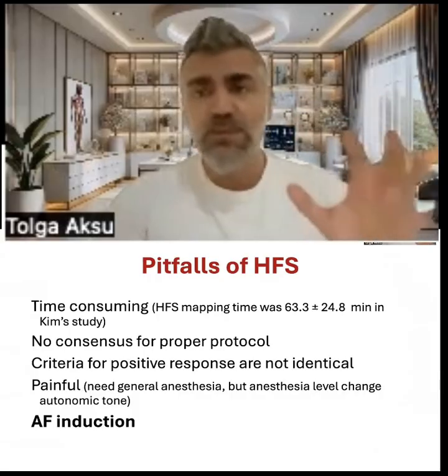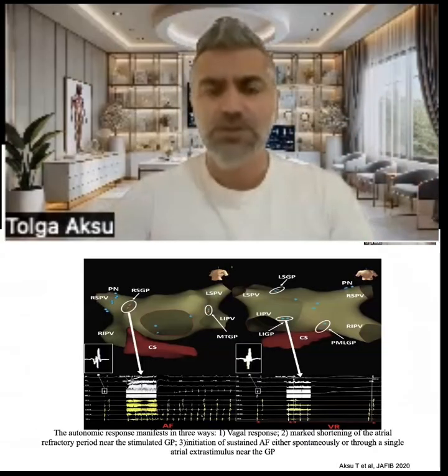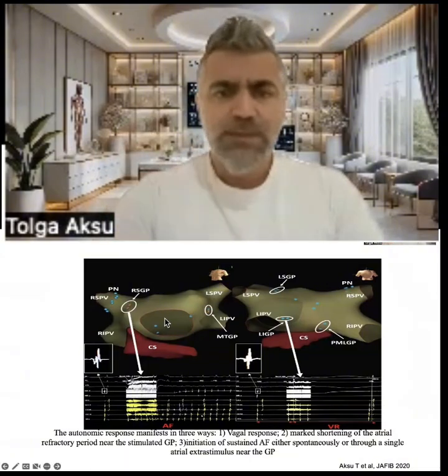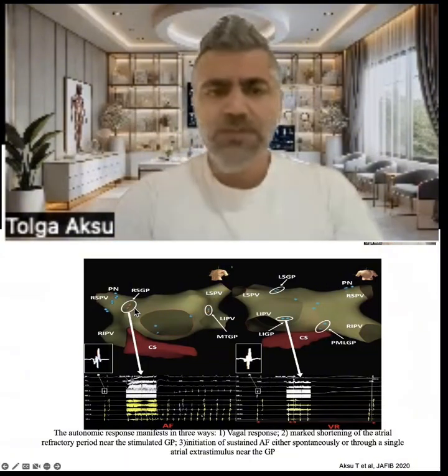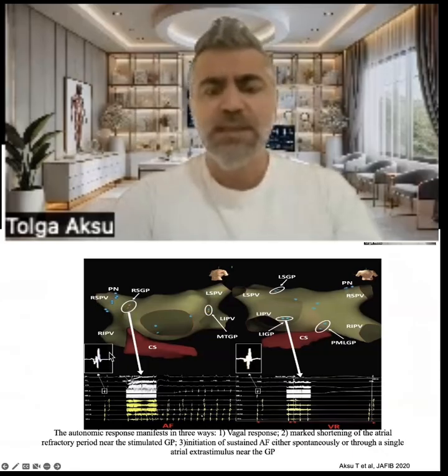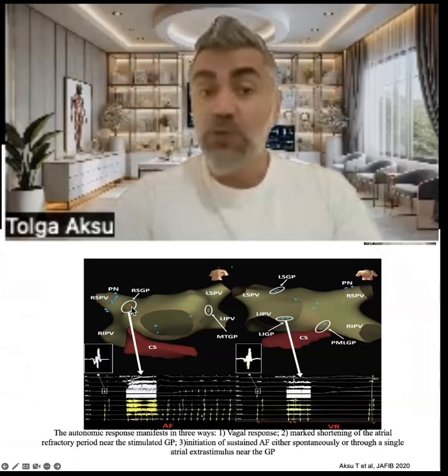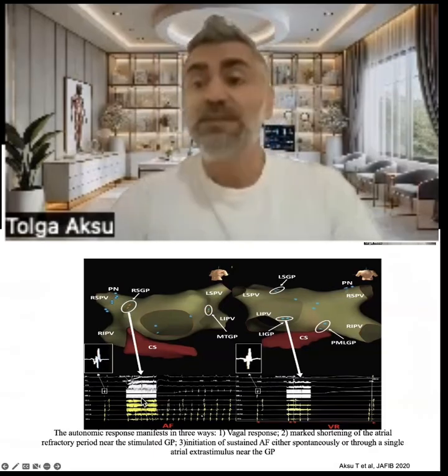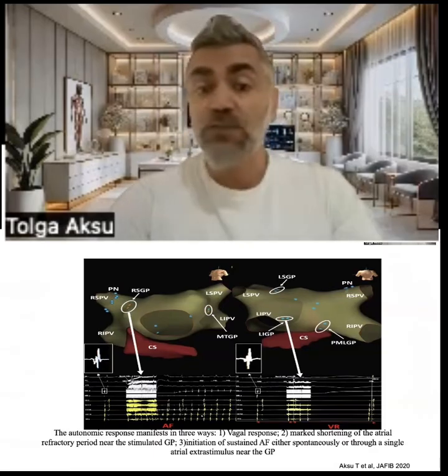But I think that the most important limitation is AFib induction. I would like to mention just 2 examples about the HFS response. For example, according to our experience, we are seeing fragmented electrogram and we are on right superior GP area. And during HFS application, we couldn't induce vagal response. Actually, we induced atrial fibrillation.